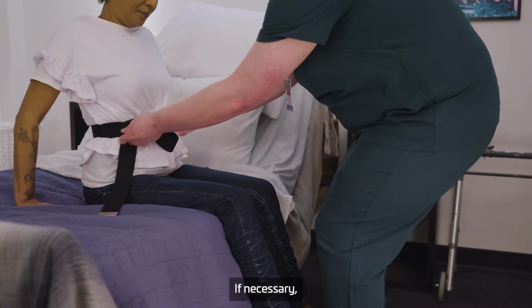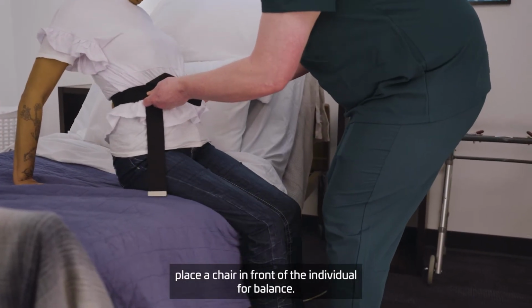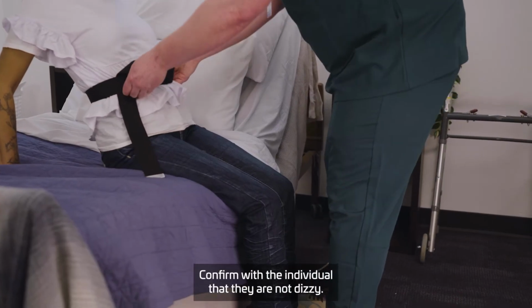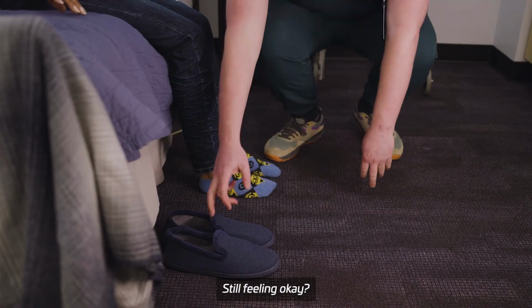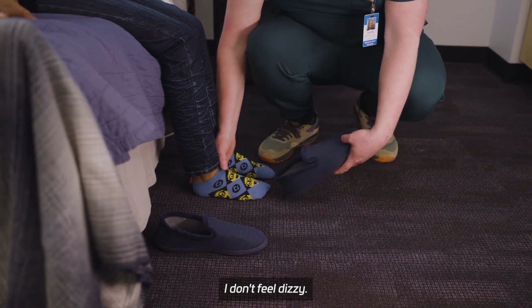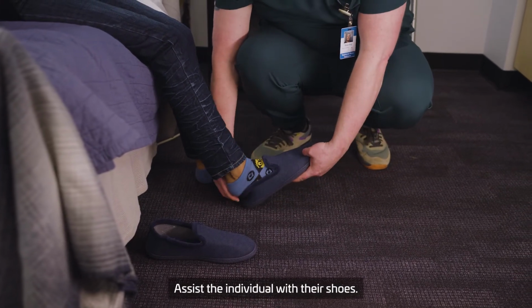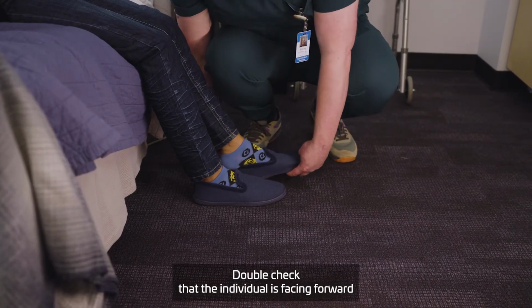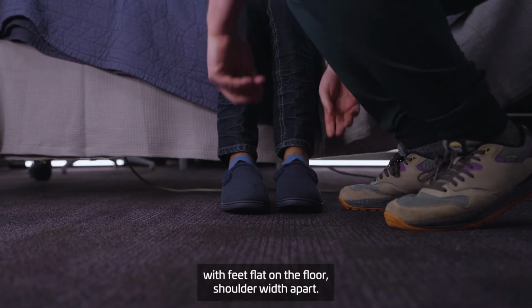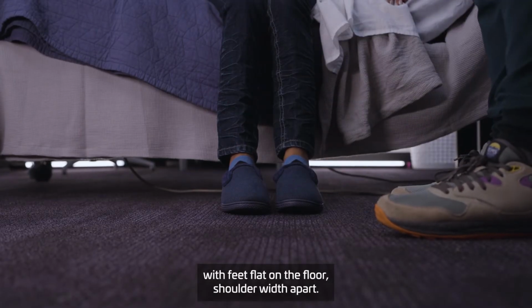If necessary, place a chair in front of the individual for balance. Confirm with the individual that they are not dizzy. Still feeling okay? Yes. No dizziness? I don't feel dizzy. Assist the individual with their shoes. Double check that the individual is facing forward with feet flat on the floor, shoulder width apart.